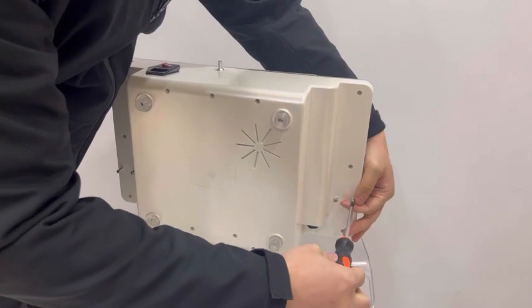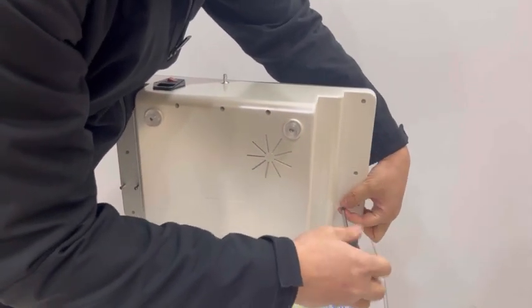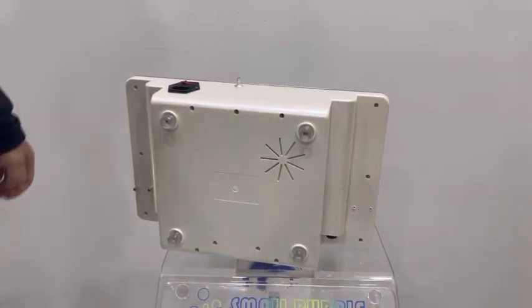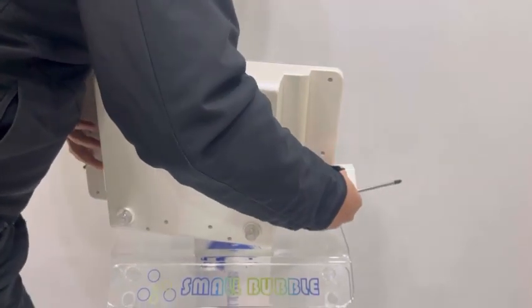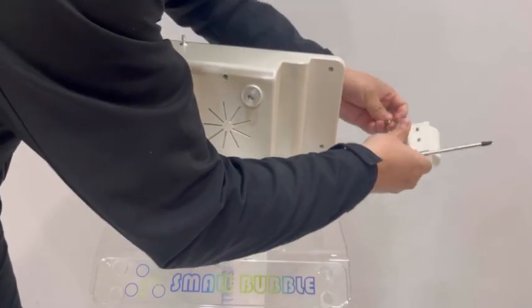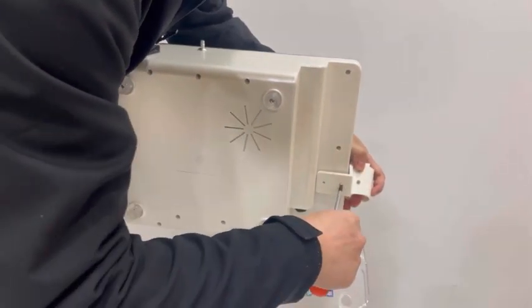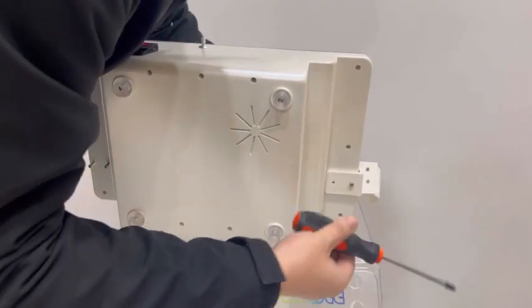You need to remove the screw from the machine. Put the holder on it and tie the screws.